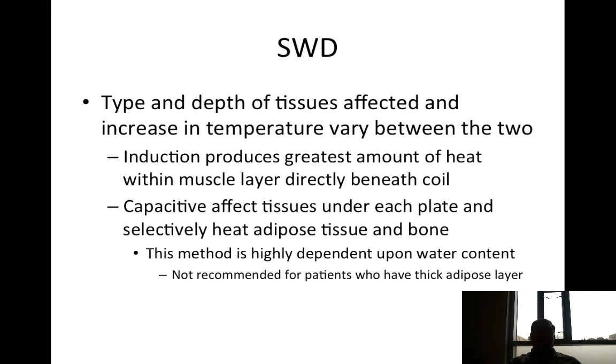This method is very highly dependent upon water content, since adipose is made up of a lot of water. It's not recommended for patients who have thick adipose layers. So again, that's the nice way of saying that you have some extra fat going on.